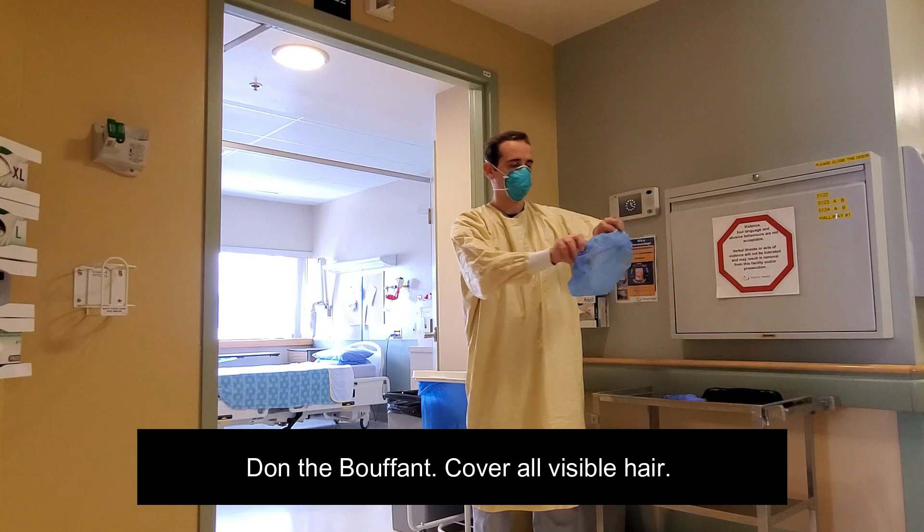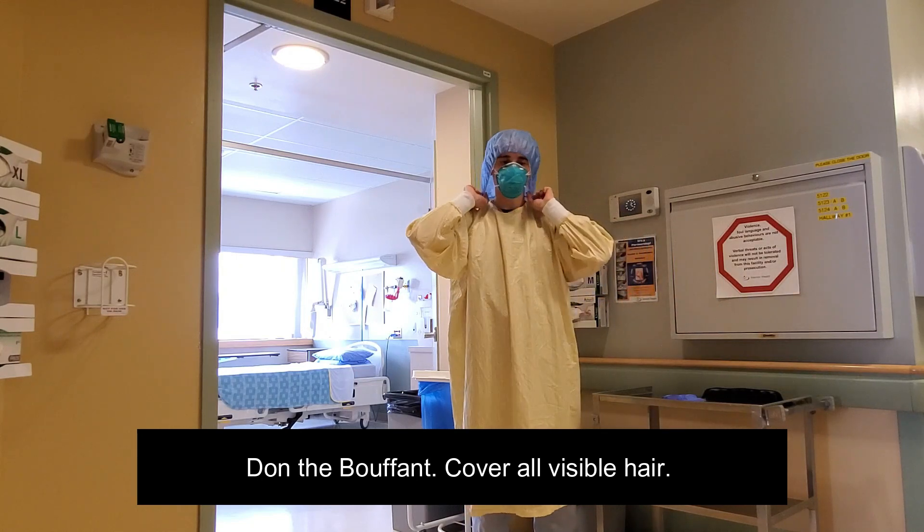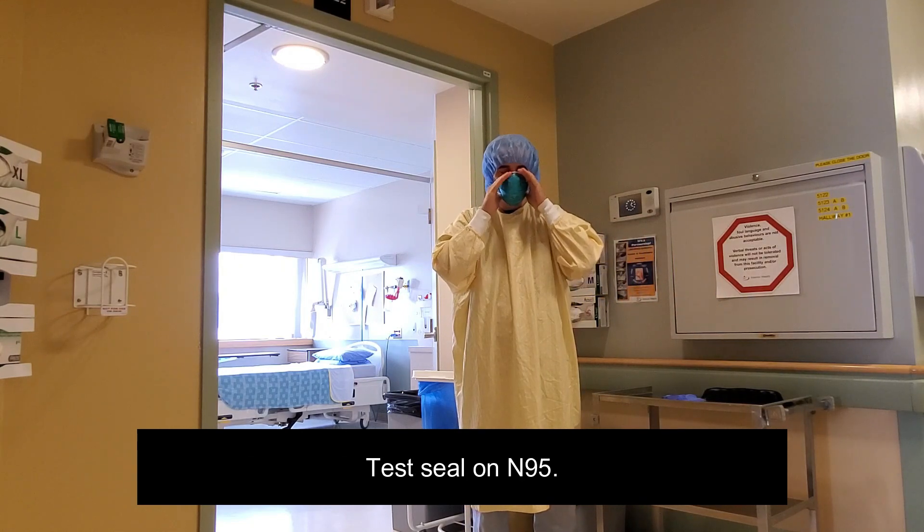Don the bouffant, ensuring that you are covering all visible hair. Perform a seal test on the N95 respirator.